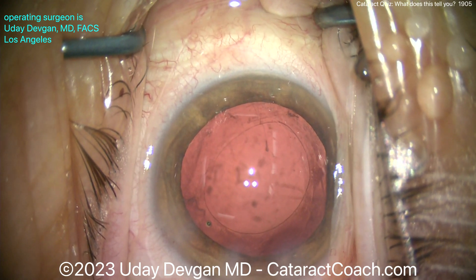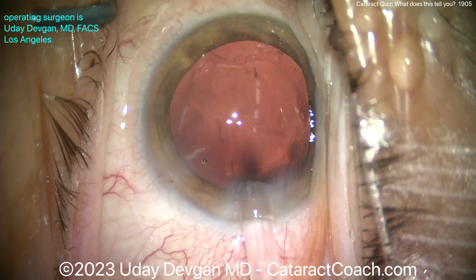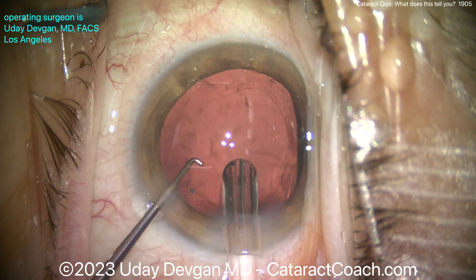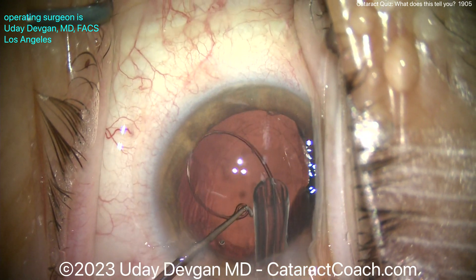Now let's get a CTR in the eye. Here's a CTR method I like — using a Sinski hook to capture that leading eyelet and dial it in. This is a very gentle way of doing it; you can use other methods as well. Here comes the CTR in the injector — I'll advance it a little bit just to expose that leading eyelet. There it is — hold that with the Sinski hook, and now deliver, deliver, deliver.